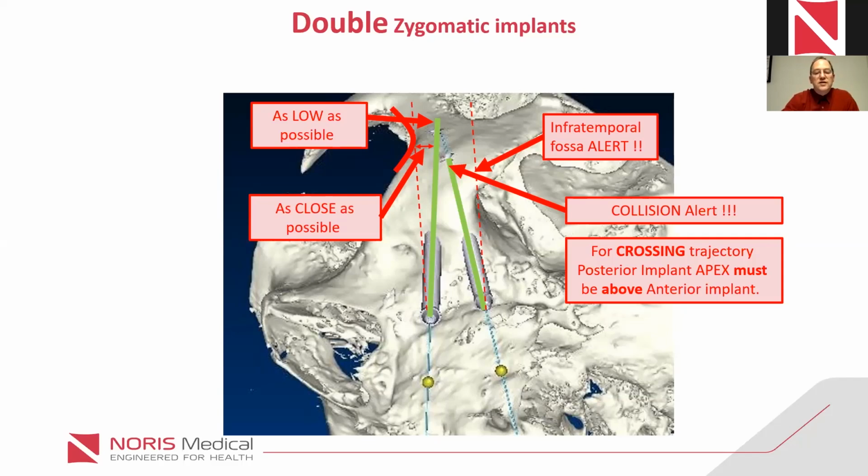Which thickness of bone may I expect in which area if I need a strong screwability? If you mean amount of bone for the threaded area of the implants or on the crest, I'll answer both. Let's start with the Zygoma bone. On the Zygoma bone, you need to have bone to anchor the implant in it.